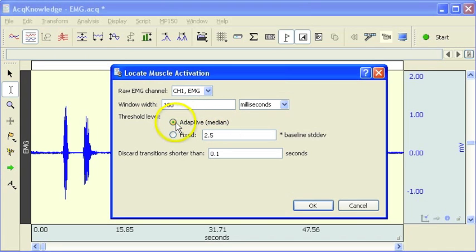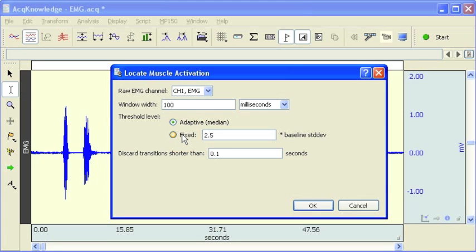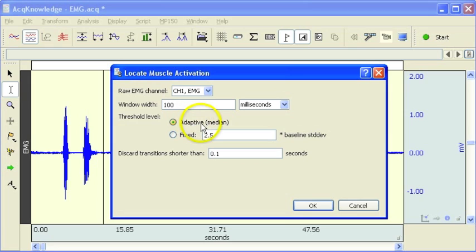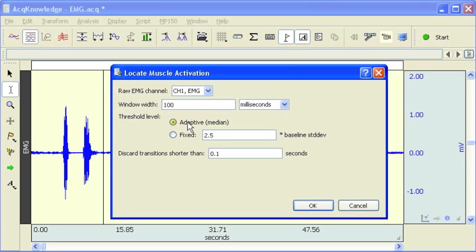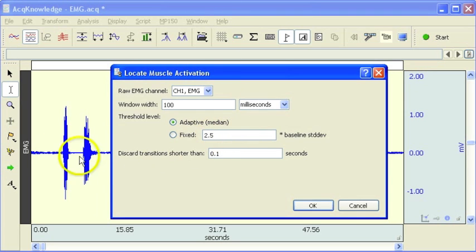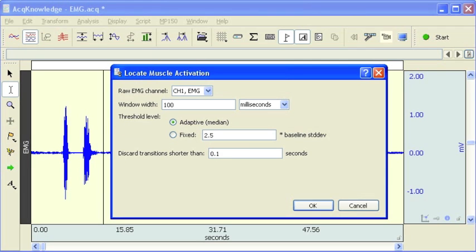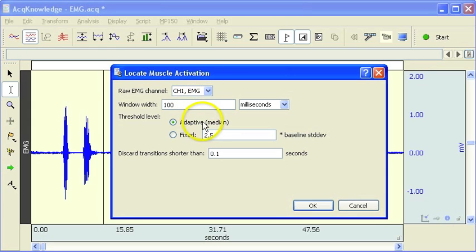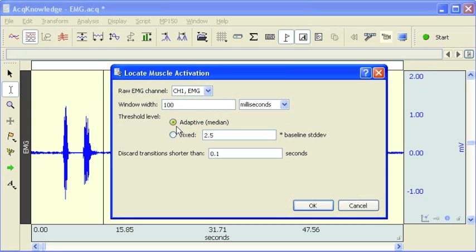And then we have two options for detecting the muscle activity. The first is an automated routine that's using an adaptive type threshold. Basically what's going to happen is it's going to look at the baseline noise and extract the variance of the signal with respect to the noise, and this usually works reasonably well without any modification, so we'll start with that option.